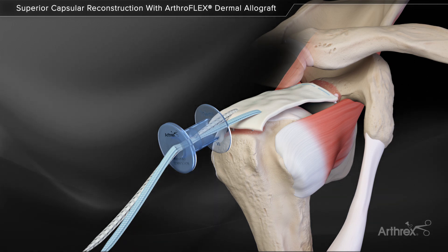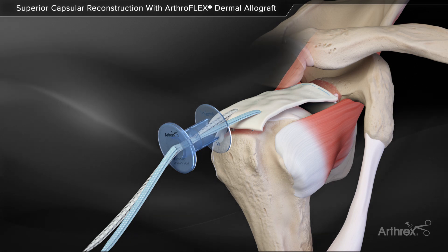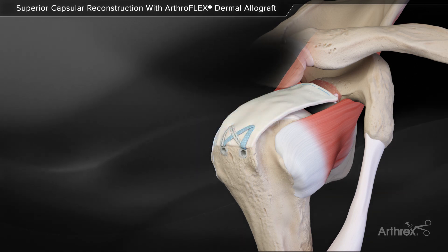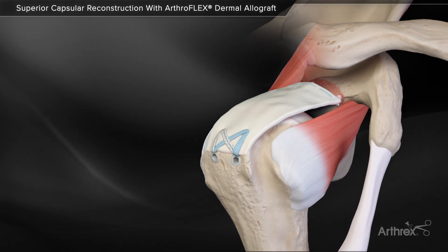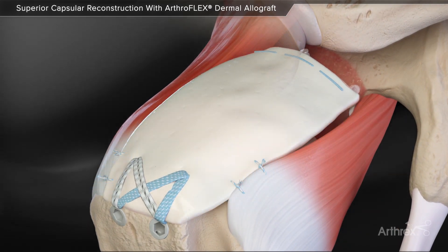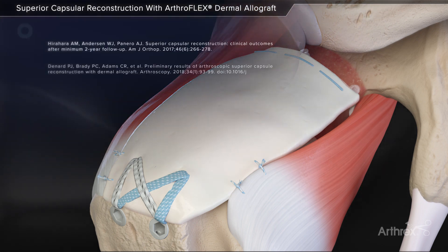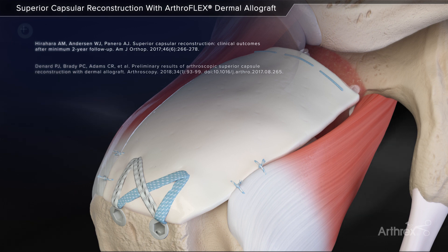Once the medial side is complete, the humeral side is fixated using a standard knotless speed bridge repair to maximize fixation strength and enhance footprint compression between the graft and bone. Margin convergent sutures are added anteriorly and posteriorly between the ArthroFlex and remaining rotator cuff tissue. The completed superior capsule reconstruction helps reduce superior humeral translation and improve shoulder kinematics by anatomically replacing the superior capsule.